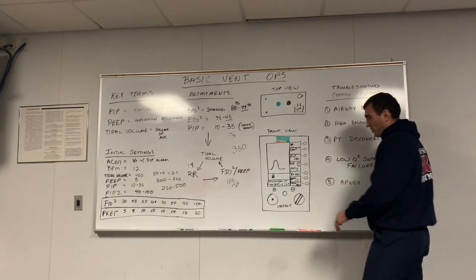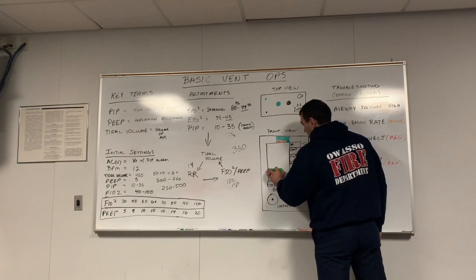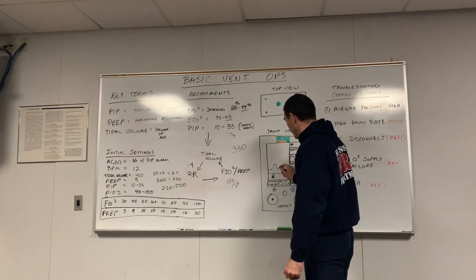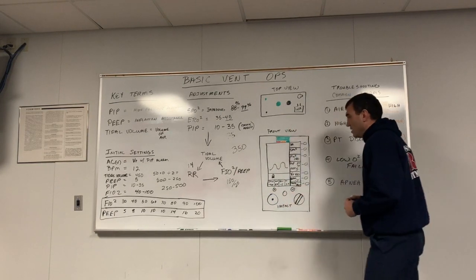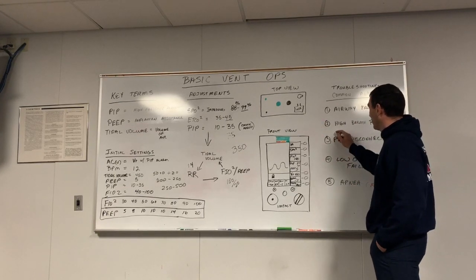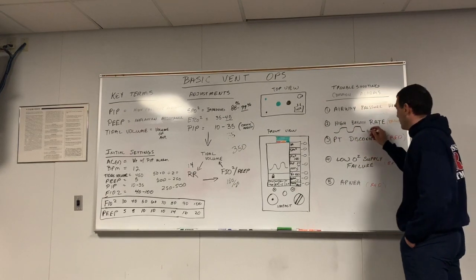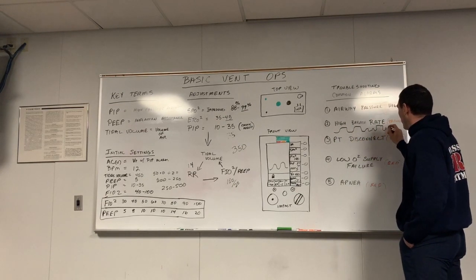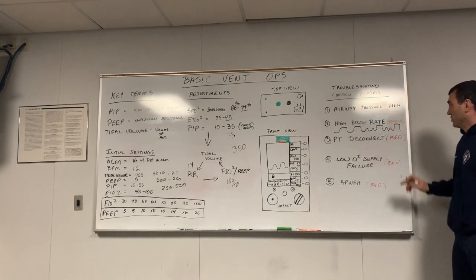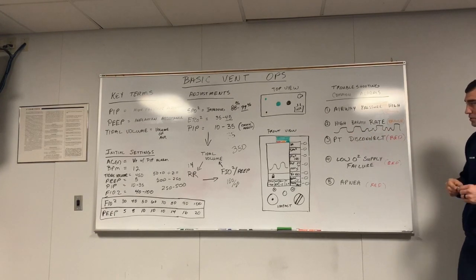Okay? There's also another thing that you'll notice on the front of your ventilator, okay, is it shows you the breaths that the ventilator is giving, right? It'll show you what you're putting in, okay? Then under end-tidal CO2, when you have this breath rate, if I go to my end-tidal CO2, the next thing I can use it for, you'll see nice, pretty breaths that you're giving. And then in between those, you'll see random small ones, okay? So the ventilator's reading each of these breaths. So you're giving 12 breaths, but the patient's breathing between those, causing that actual rate to be higher.